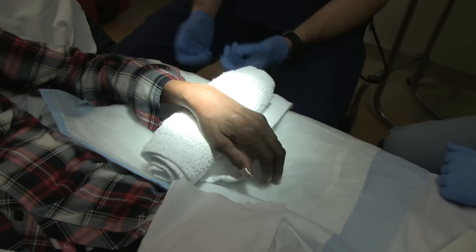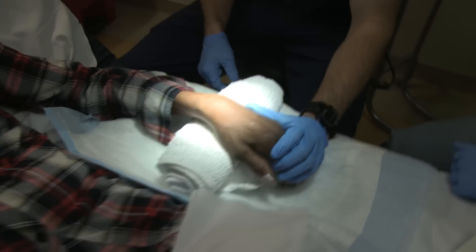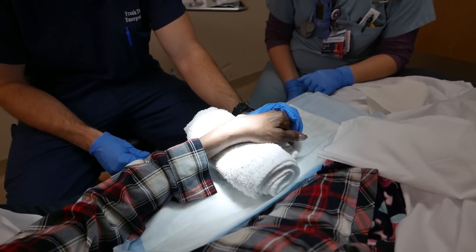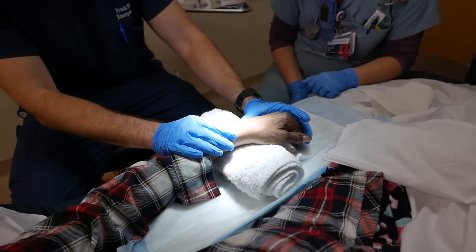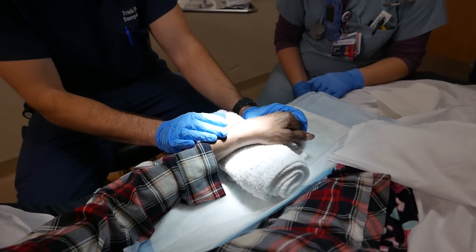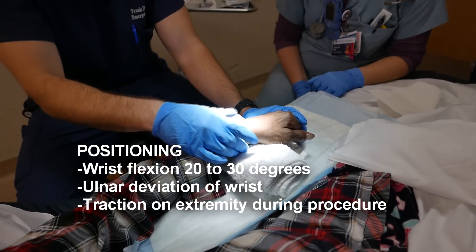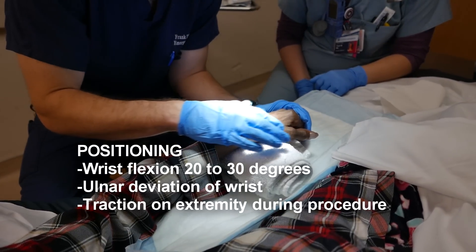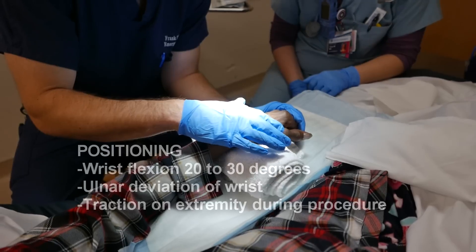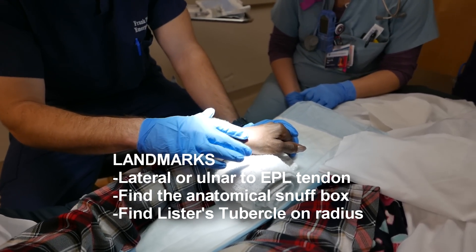The first thing is you want to find your landmarks, just like for any joint aspiration. To get set in the appropriate manner, you want to have the patient deviate their wrist ulnarly — she's having a little tenderness because her wrist hurts — and put it about 20 to 30 degrees of flexion. What I'm looking for is the joint space, and I'm going to use the extensor pollicis longus tendon as my predominant landmark, going just ulnarly to it in the joint space.